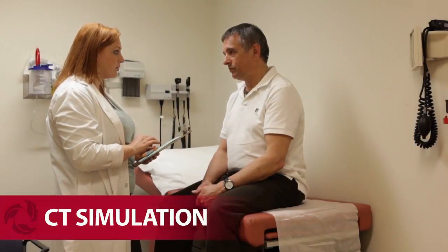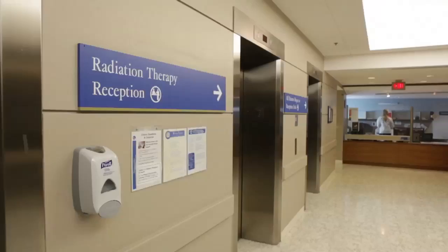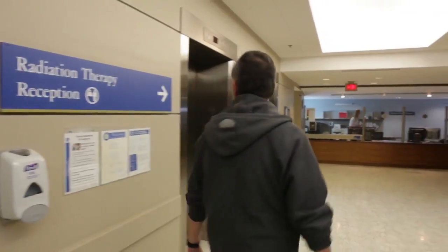After your initial consultation with the radiation oncologist, where it has been decided that you will have radiation therapy, you'll be given an appointment for CT simulation.